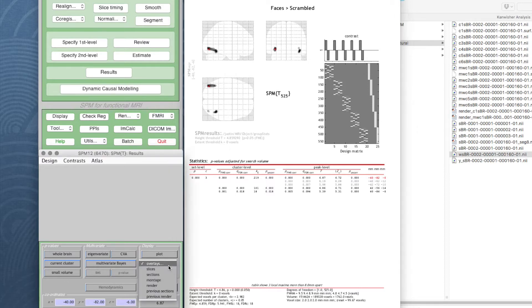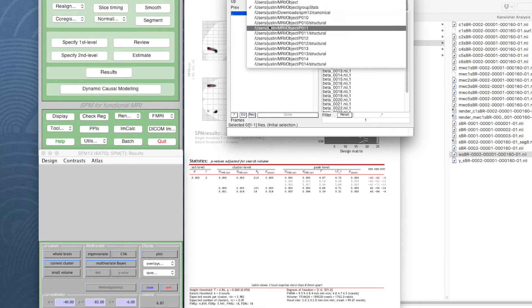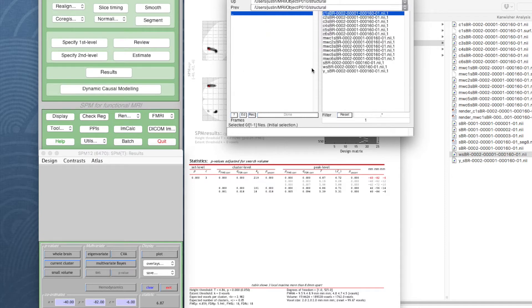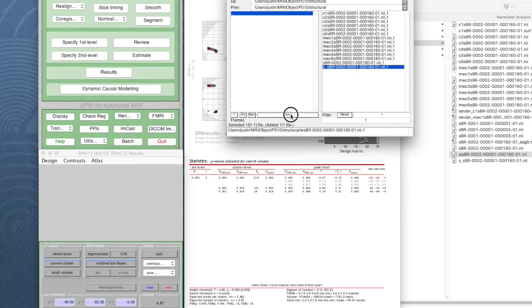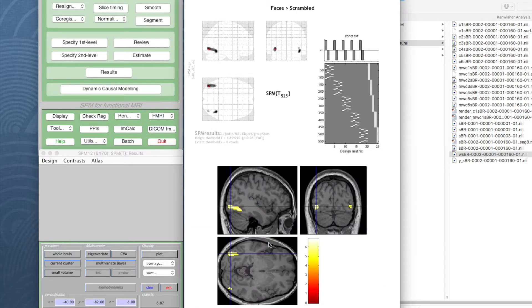We can choose any one of our participants and use the warped structural image, and this is going to give us a better idea.